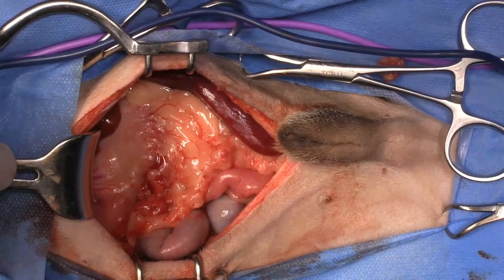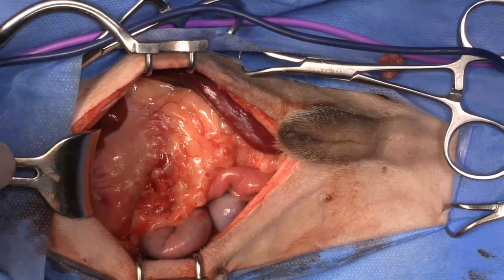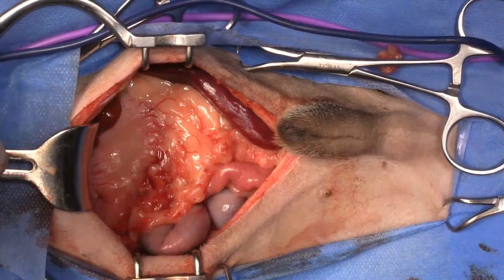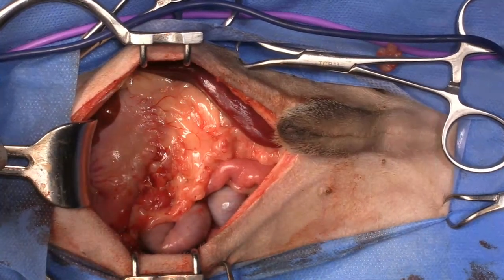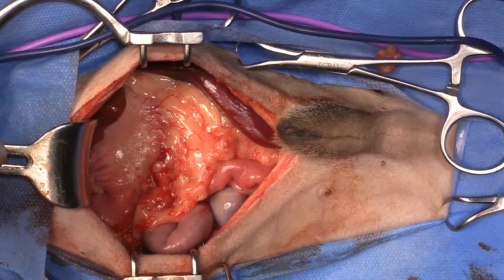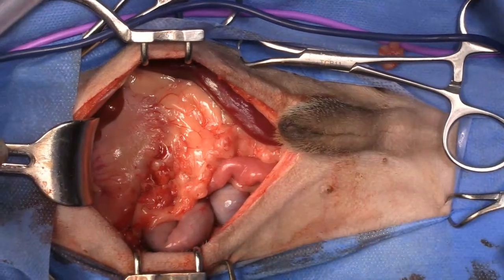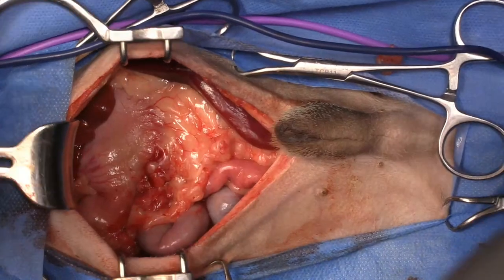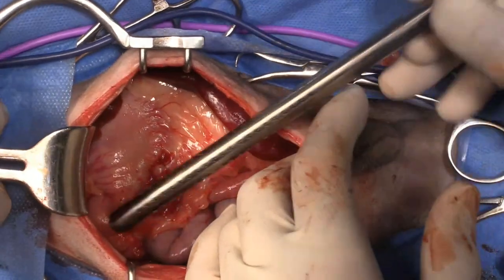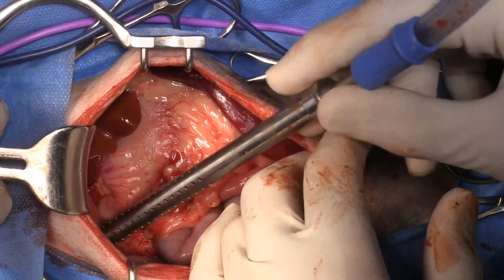So there's a question about when I would use cellophane band versus a ring. And this dog is just so small and that shunt is so flimsy that I'm worried about using a ring and weighing down the shunt, which would cause acute occlusion and portal hypertension. Is that too warm? Yeah, I'm just getting a smidge in there.